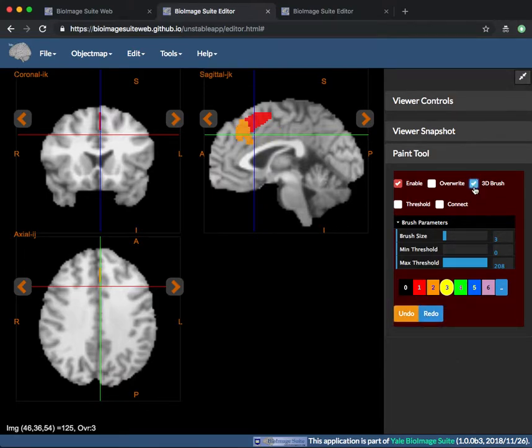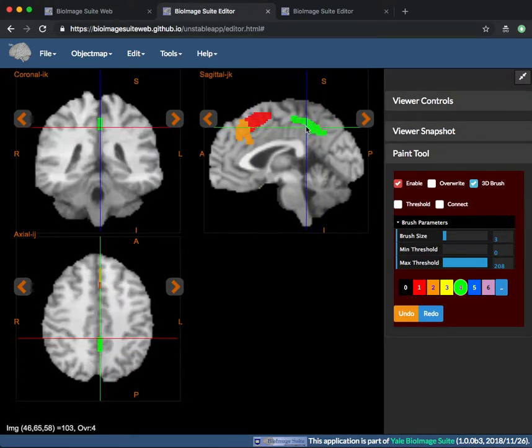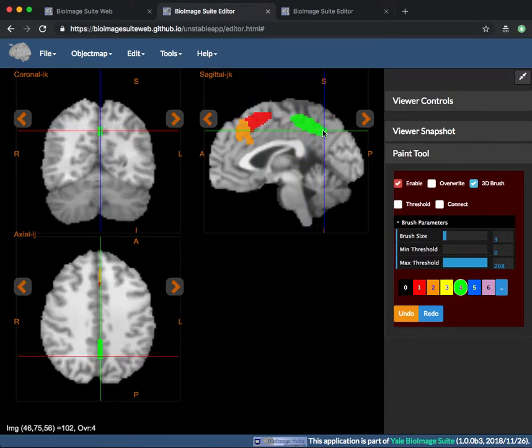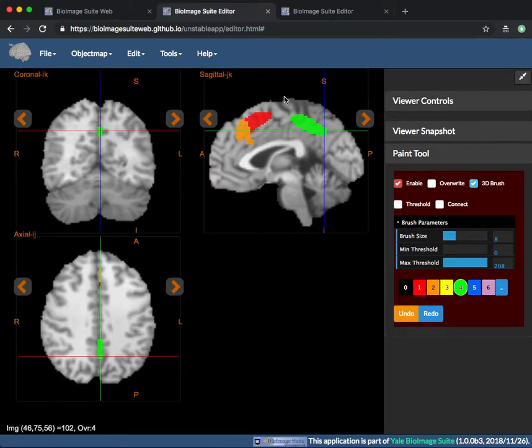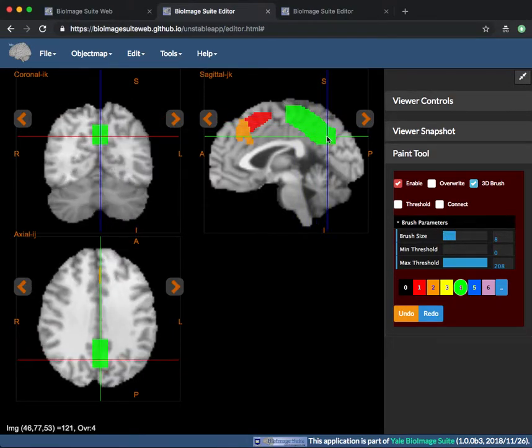If the 3D brush is checked, the painting is done with a brush that extends to multiple slices. Otherwise, the image is colored only on the current slice. Making the brush size larger allows the coverage to extend to more slices.